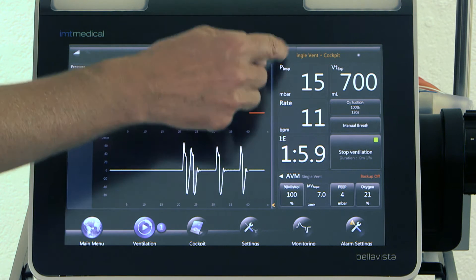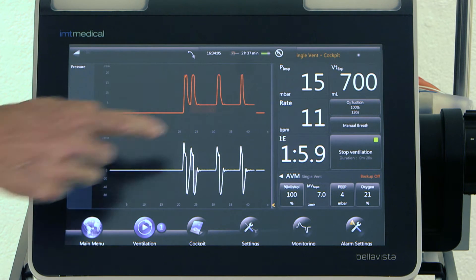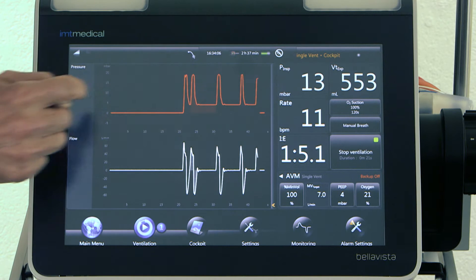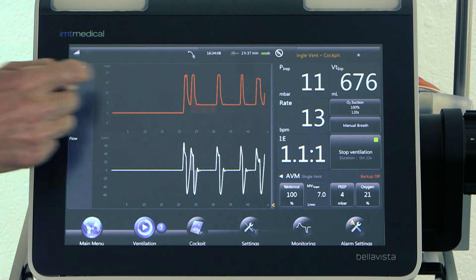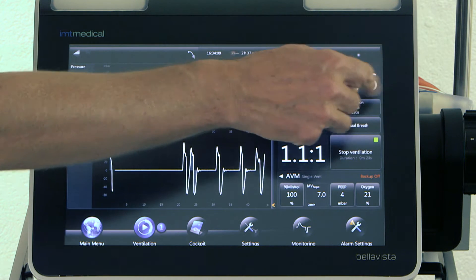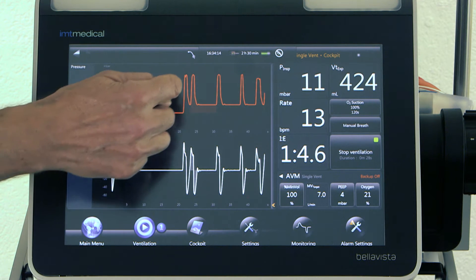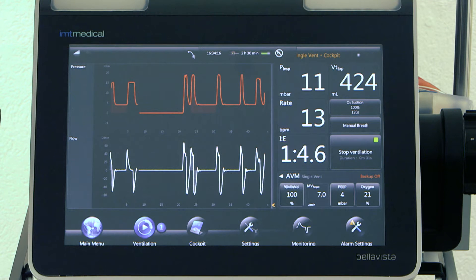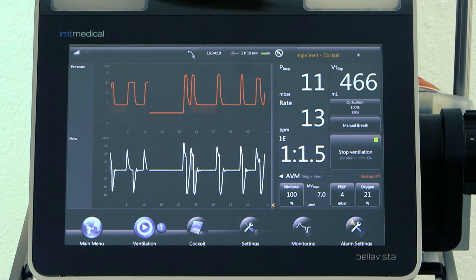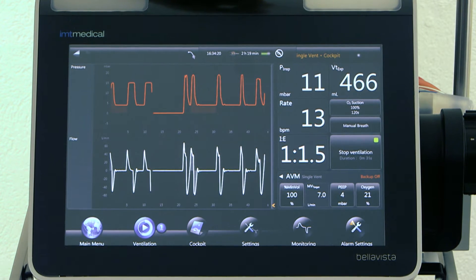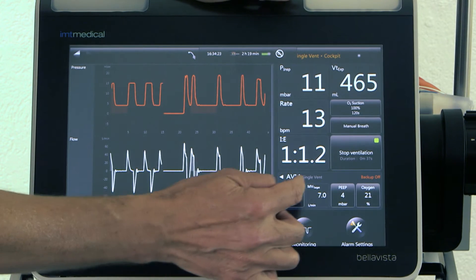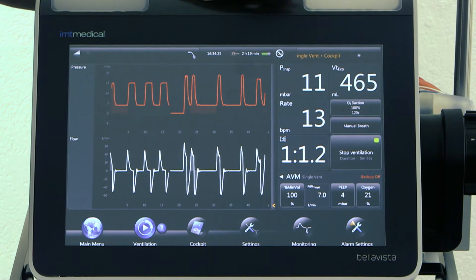There is a default inspiratory pressure of 15 millibar, a default rate of 8, and tidal volume results in around 600 milliliters. Now the mode has started to regulate — it is reducing tidal volume and increasing rate until it arrives at the set minute volume of 7 liters per minute.